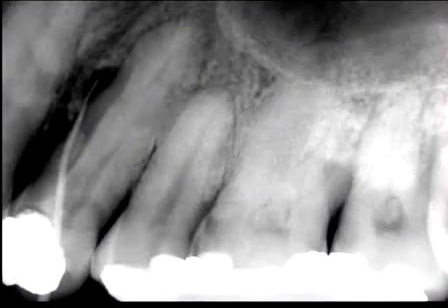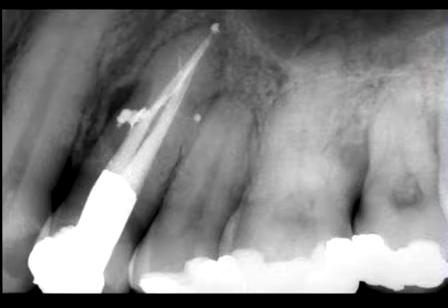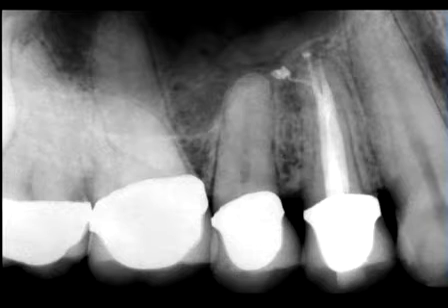In this case, we have a gutta-percha point tracing a fistulous tract to a lateral root lesion. This video will emphasize the importance of diagnosis, complete access, shaping the canal such that our irrigants can penetrate into all aspects of the root canal system, and packing in 3 dimensions. The follow-up film shows complete healing. Let's look at some root canal systems.